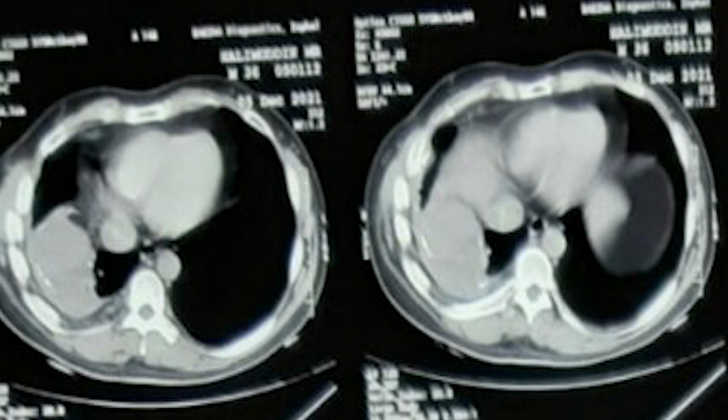We were surprised that it came back as tubercular. So maybe it was a giant Rasmussen aneurysm. We never imagined that it could be Rasmussen, but with a sequestered lung. The supply was coming from below, and it was immediately filling. So it was a sequestered lung, and because of that, TB settled there. Interesting.